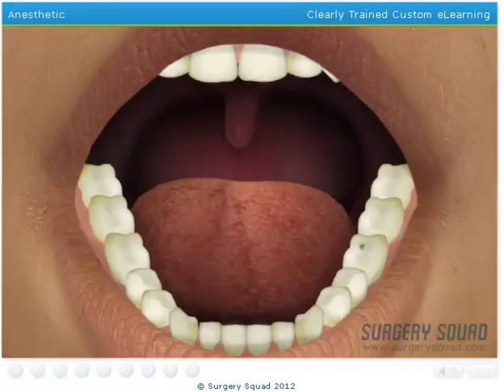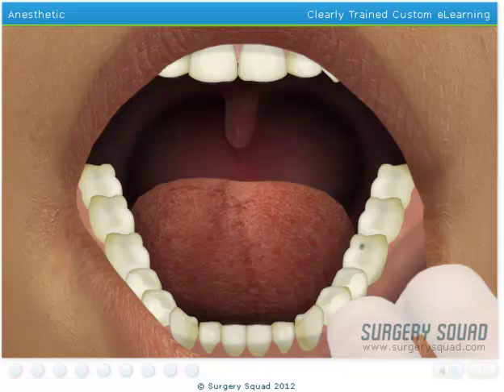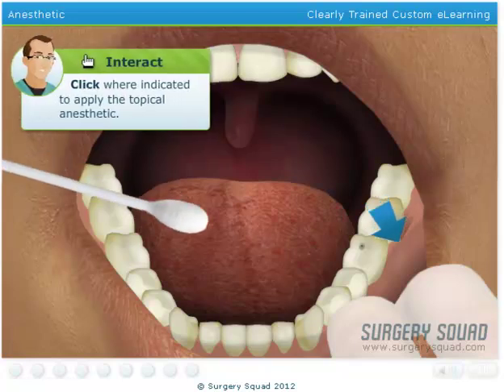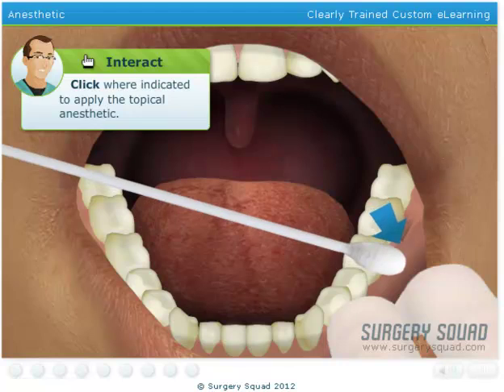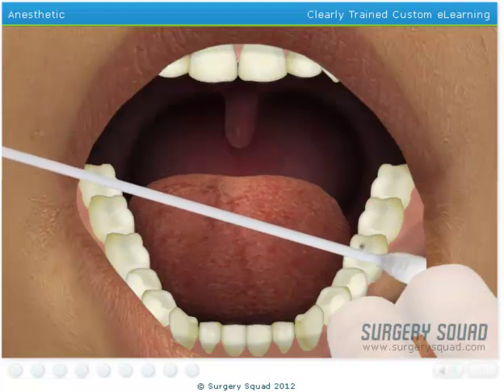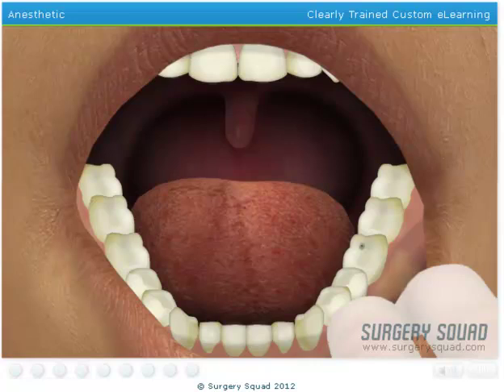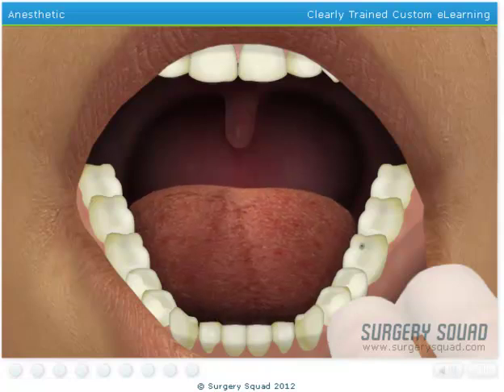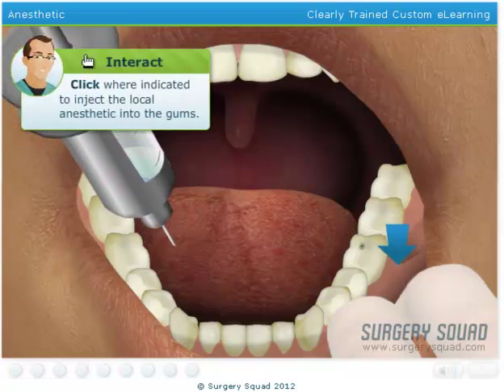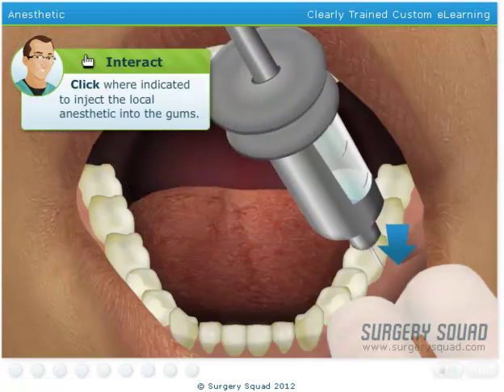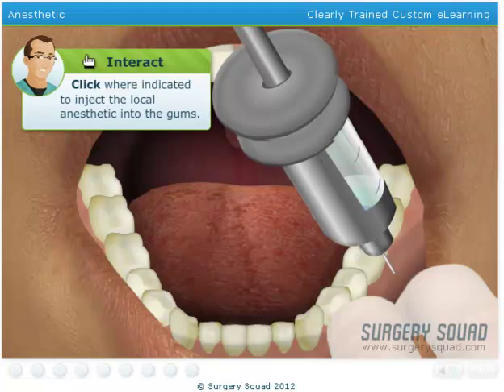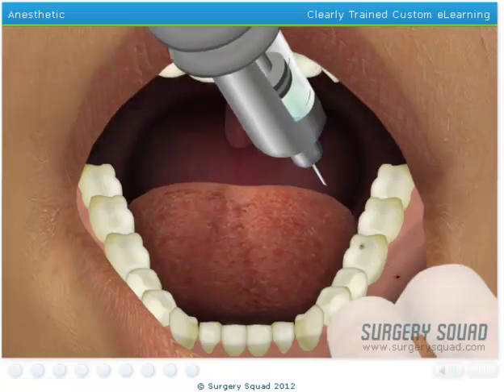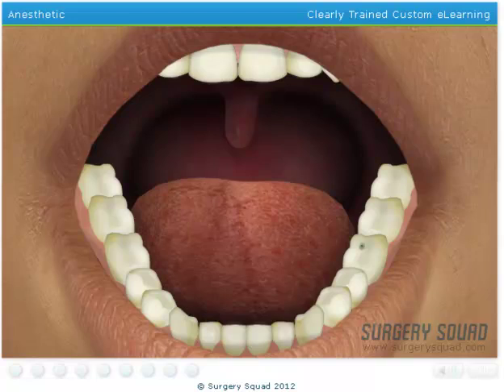Now that you've identified the cavity, we need to apply a topical numbing gel to the anesthetic injection site to help reduce any discomfort the needle may cause. Next, we can administer the local anesthetic. The patient will, at most, feel a slight pinch. Afterward, the area will become numb for hours, even though the procedure will only last a few minutes. Take the syringe and inject the local anesthetic into the patient's gums, just below the tooth we'll be working on. Now we'll give our patient a few minutes to become completely numb.